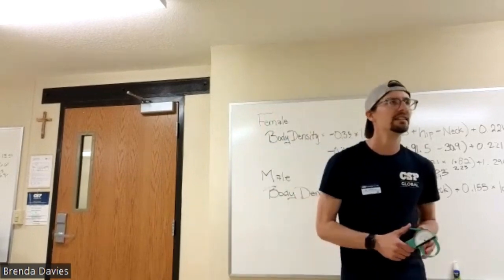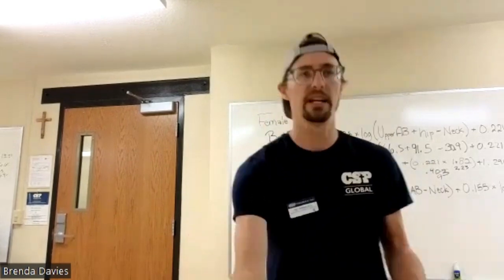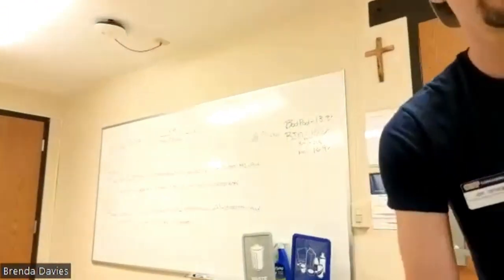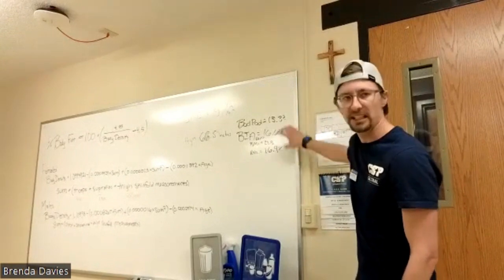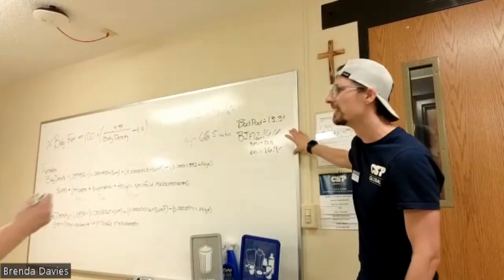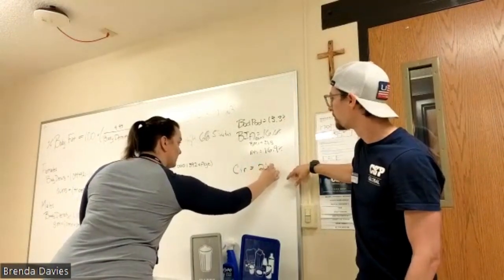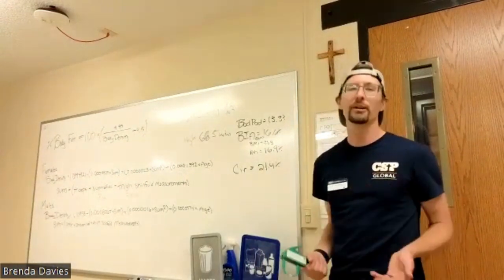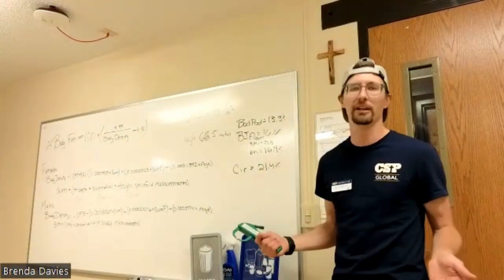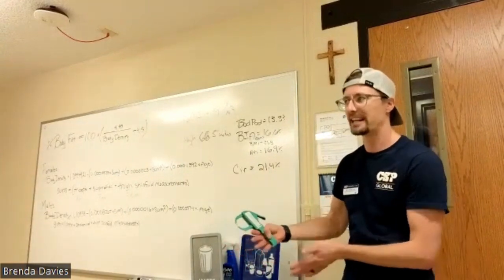So 21%. From circumference was 21%, so you can see, compared to, here, if you look here, we've got Bod Pod at 13.3, we've got BIA at 16.7-ish, somewhere around there. We've got circumference at 21.4%, so there is variation in this. They're all estimates. The most accurate one is the one that you can't recover from, being dissected. You can't get as accurate as a dissection.